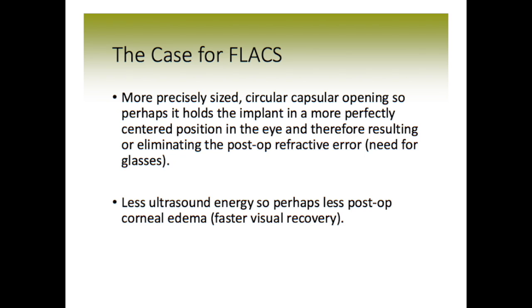In other words, less need for glasses because the implant is going to be somehow better centered within the capsular bag because the circular opening made in the front of the bag was more round and centered.